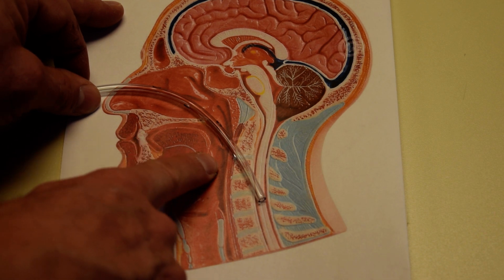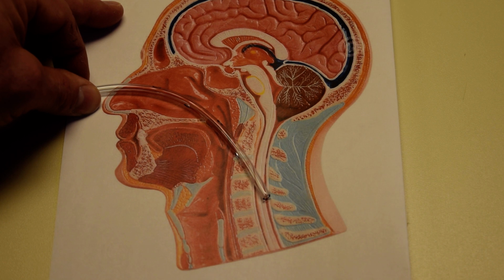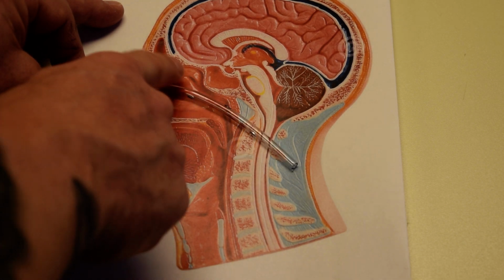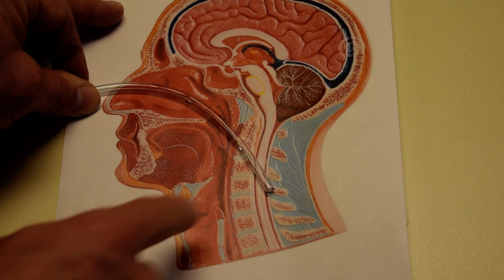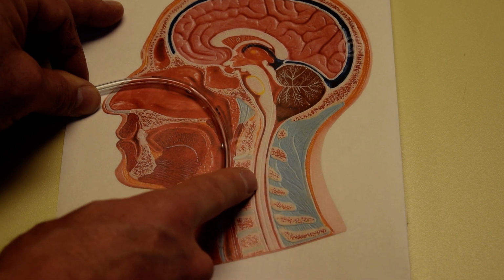You can assess through the mouth. You can have them open their mouth and see if you can see the end of your tube in the back of the mouth, and assess how that's going. Because again, the most difficult piece for them to tolerate is getting through this nasopharyngeal space. You're already there. You don't want to pull out from there if you don't have to. So you can open their mouth, reassess, look at the back of their throat and see if you can see the end of your tube.